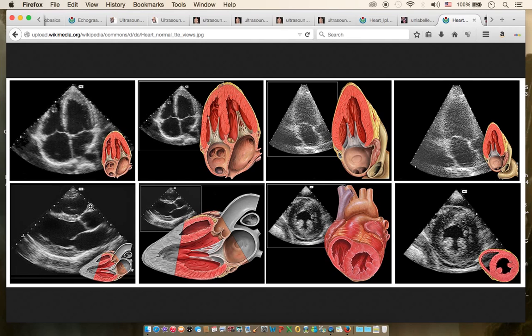This is the aorta. This is the ascending aorta, and if this ascending aorta gets enlarged, for example, if the patient has an aneurysm or dissecting aorta, you can diagnose that very easily by the parasternal axis, and it's compressing the left ventricle and the left atrium when the patient has an aneurysm or dissecting aorta.